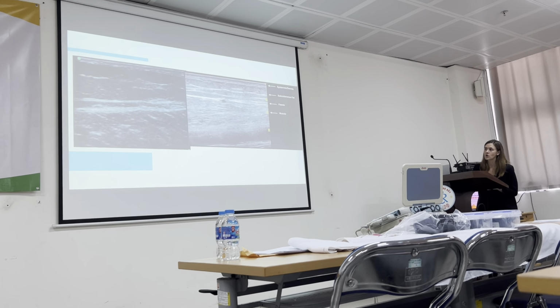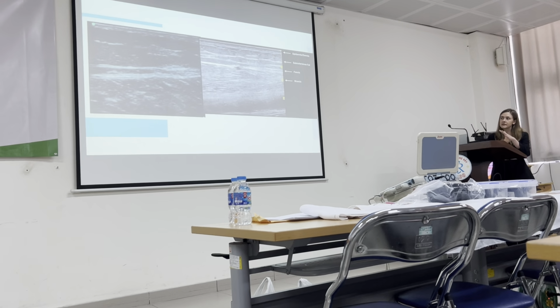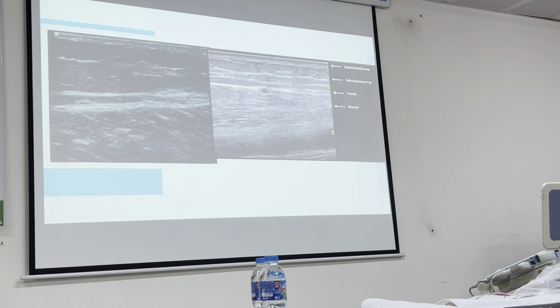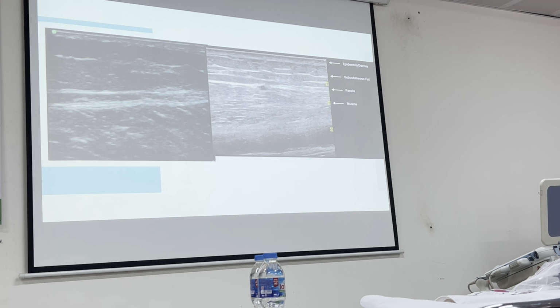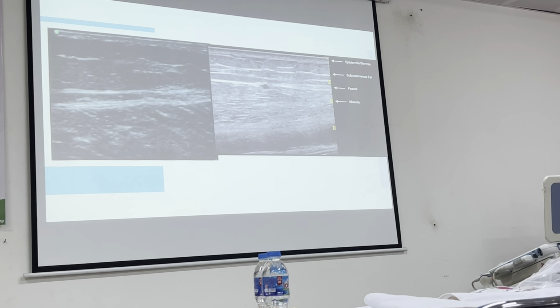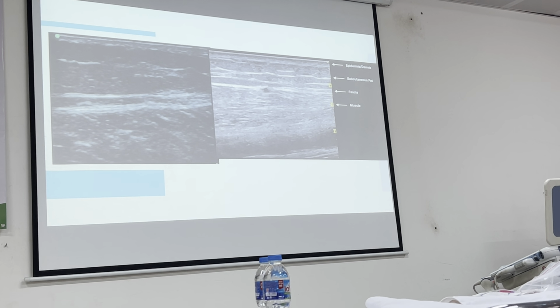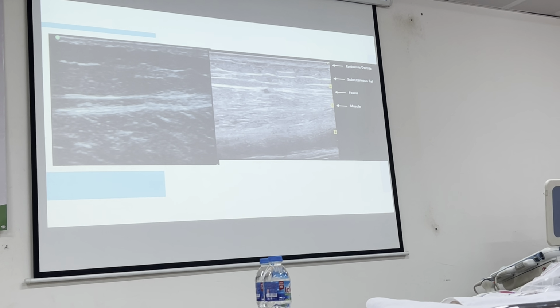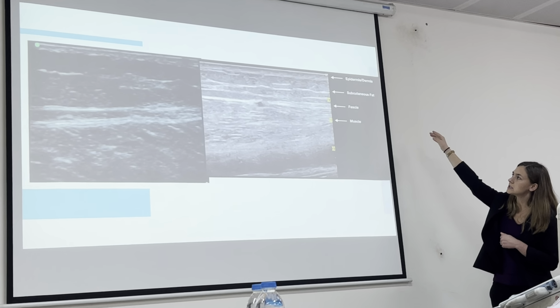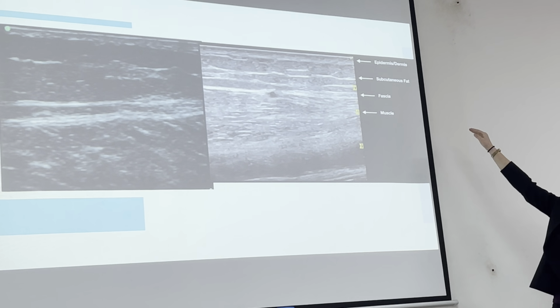So, let's go over this first. This, luckily, is a normal ultrasound of tissue. So up at the top layer, you get your epidermis and your dermis. Our top layer here is fairly thin, the epidermis and the dermis, and you can see in each layer, it's pretty organized.